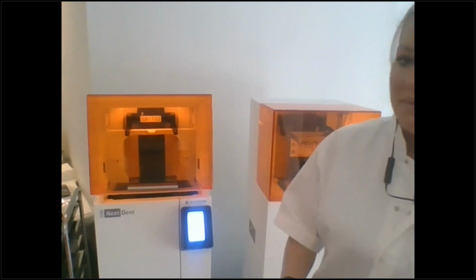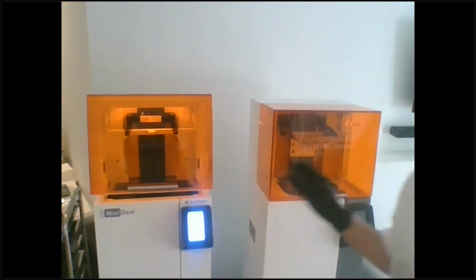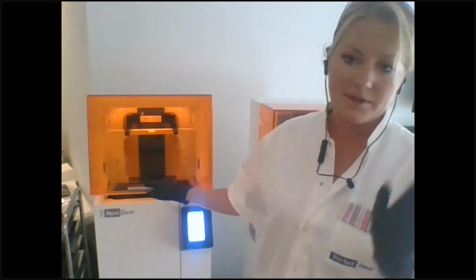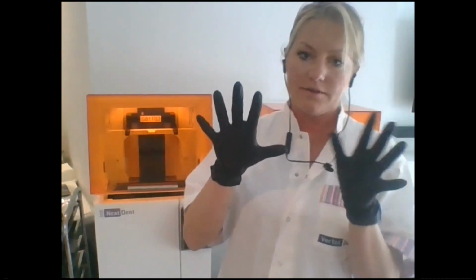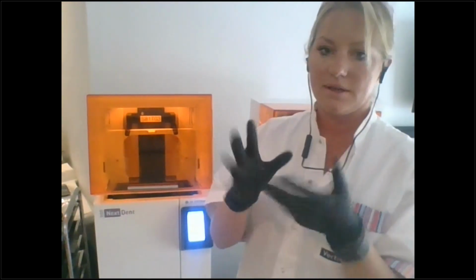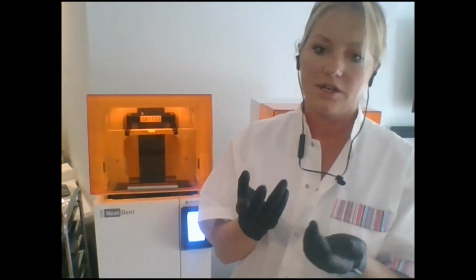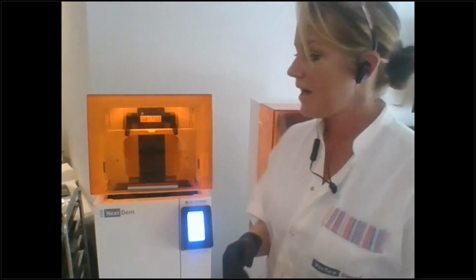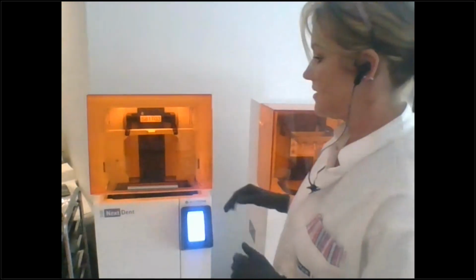Okay, so if you were with me on Friday, I showed you how to clean your membrane lip. So I'm going to show you one more time in case you're newer today and you didn't join us on Friday. So I always wear gloves when I'm going to touch my printer because some people are a little bit messier. You don't want to touch raw resin with your hands. You don't want to touch uncured parts with your fingers. And also, if you have glasses and something like that.